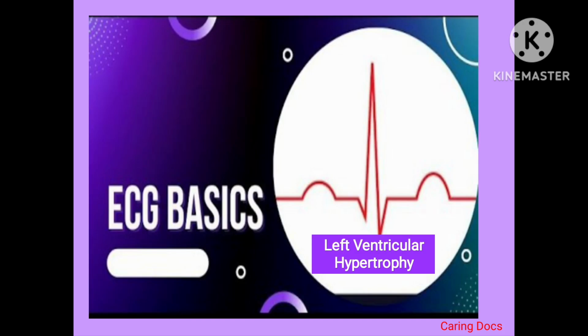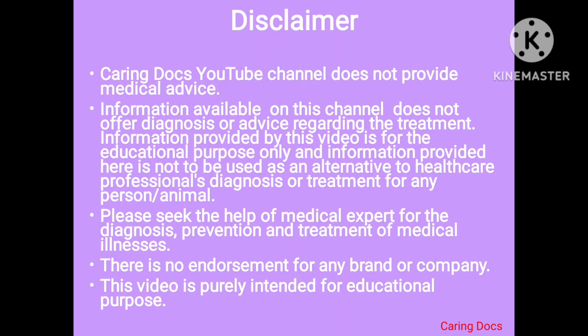Hi friends, today I will talk about ECG changes in left ventricular hypertrophy.